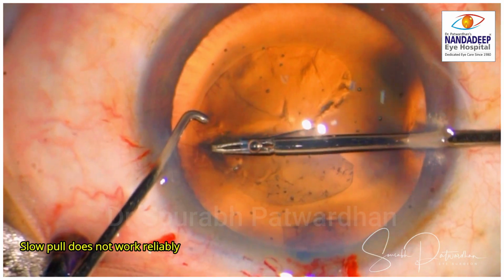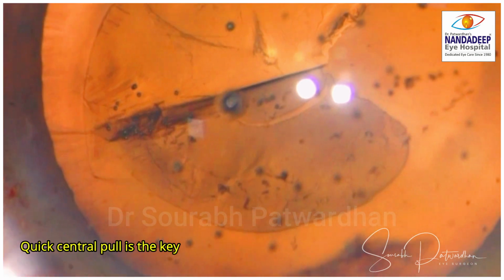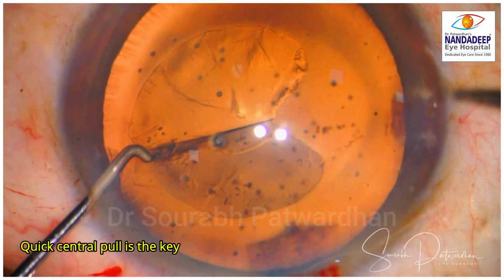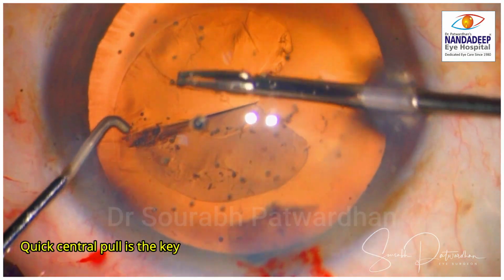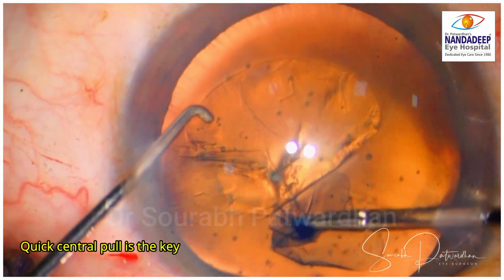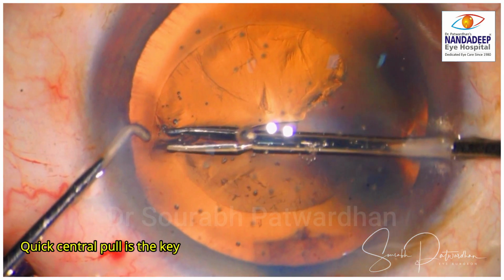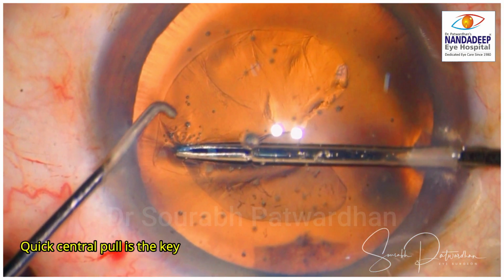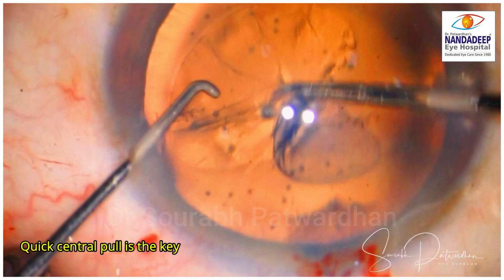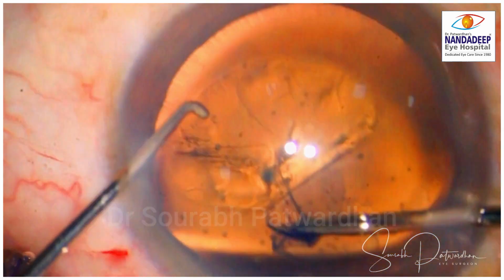The reason is that the tractional pull of the zonule is still higher. So to negate that, one must pull it quickly centripetally like this, and once it is pulled quickly, you can see the capsulorhexis tears come inside, and further extension can be prevented, and we can get a good complete capsulorhexis.